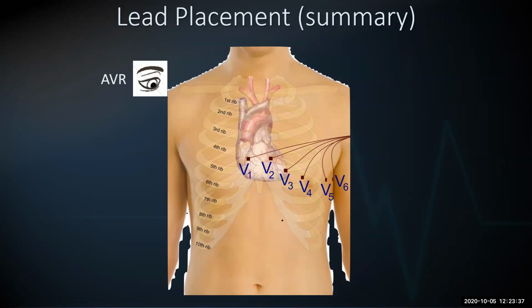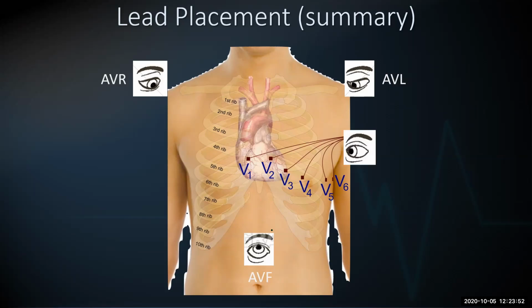So if we were to look at aVR from the upper right portion, we'd expect that to be in negative deflection. If we look at aVL, which is pretty much up here, it's somewhat isoelectric. Down here would be aVF, and we can see that that's going to be, again, somewhat isoelectric, maybe a little negative. Here would be lead 1, so the electrical activity is coming towards it. Lead 2, it's purely positive for the most part. And then lead 3, it's somewhat isoelectric as well.